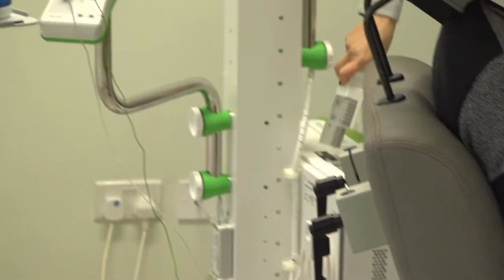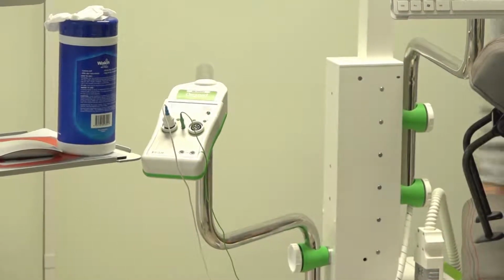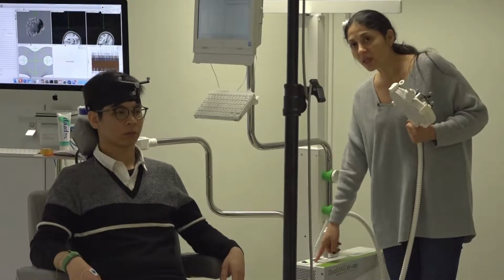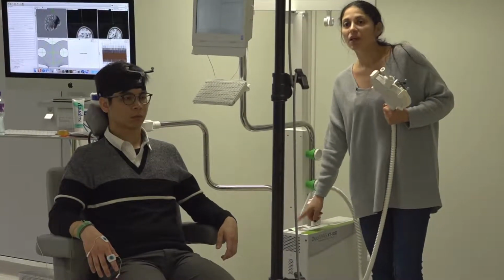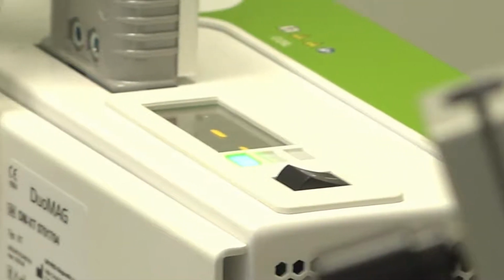You connect the coil before switching on the machine. And several things you need to take into consideration is that this should blink, show you 188, and then be green. If it doesn't happen like this, it means there is a problem with the machine. So pay attention to it. Okay?